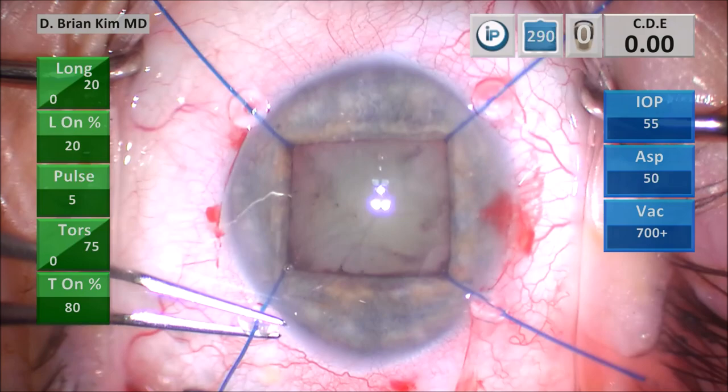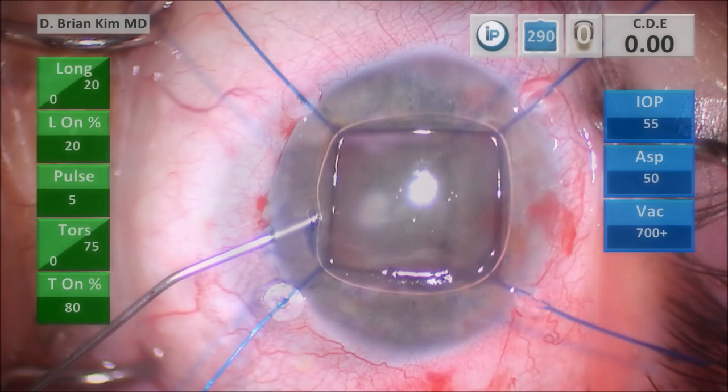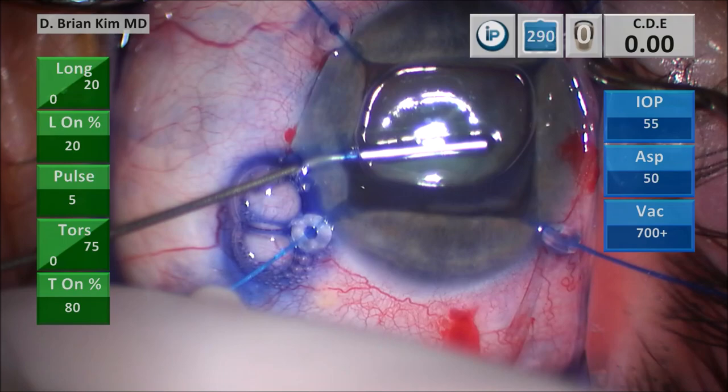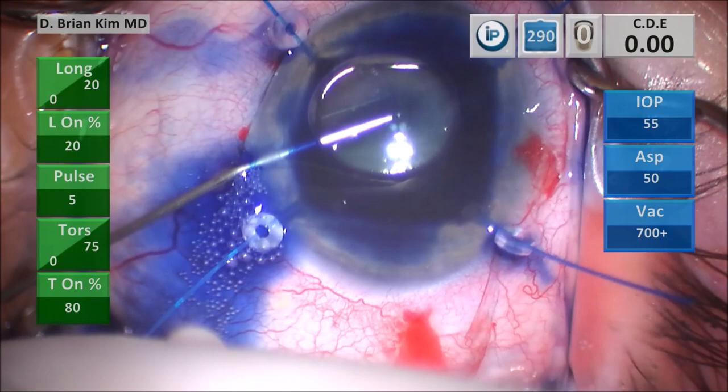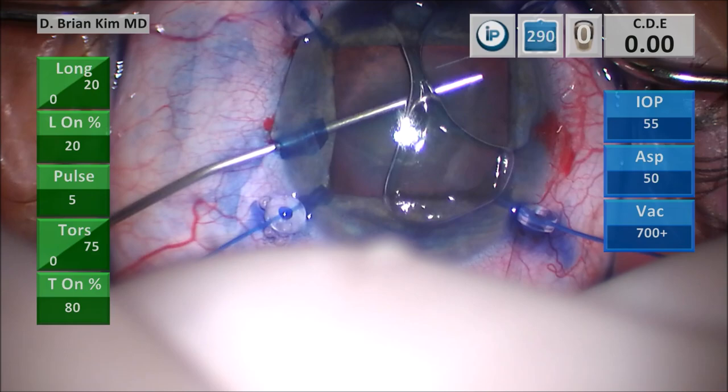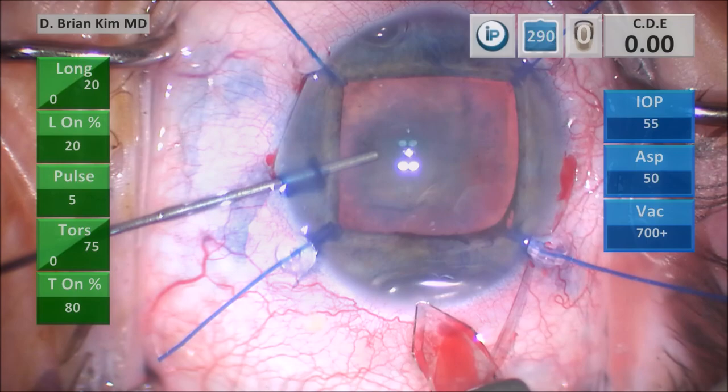I'm putting intracameral air and then trypan blue, trying to paint it on the surface of the anterior lens capsule. I'm avoiding overfill of the trypan blue to protect the endothelium — the bubble helps tamponade the dye onto the anterior lens capsule. I'm injecting dispersive viscoelastic, going across the incision and pushing the bubble out of the way. I then make my tri-planar corneal incision — a vertical groove, going into the groove tunnel through the cornea and then diving down.